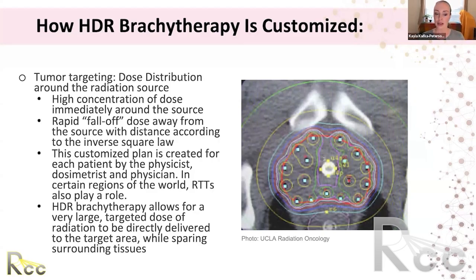The next step, which we'll talk about, is some sort of imaging that they use to create this plan, whether it's 2D or 3D. We'll get into that. Then the computer work happens where they create this customized dose. The area of red is a very high dose. This is a prostate implant. And then as the circles go out, this is my non-physicist brain explaining it.